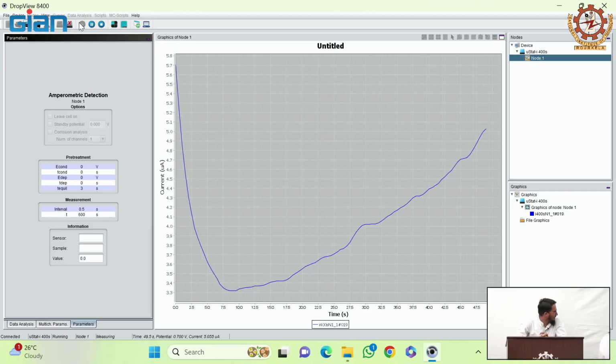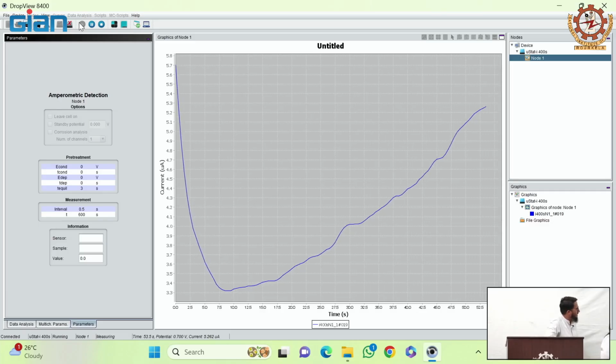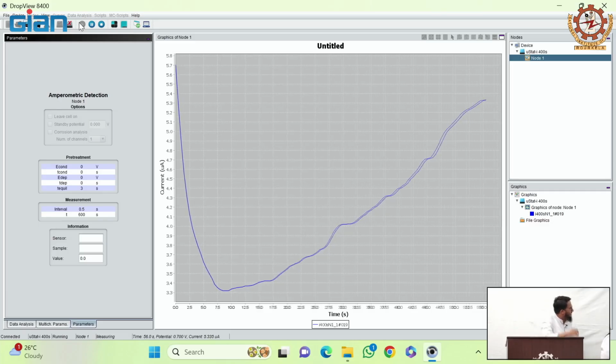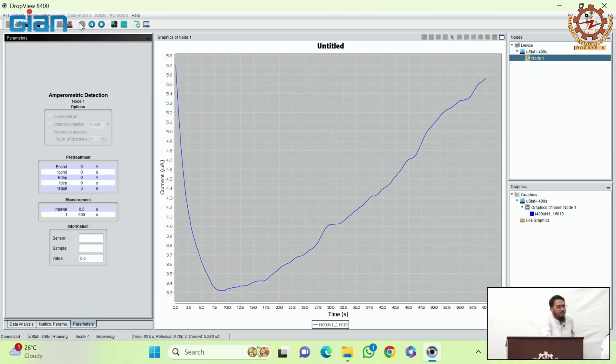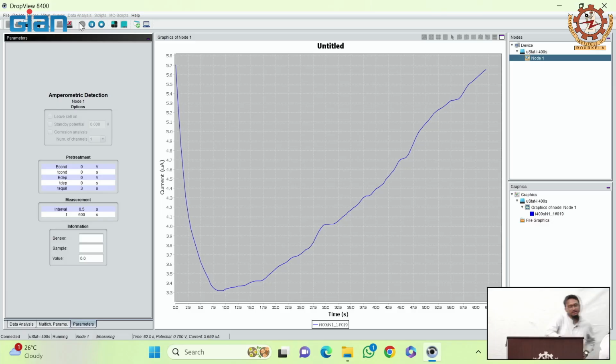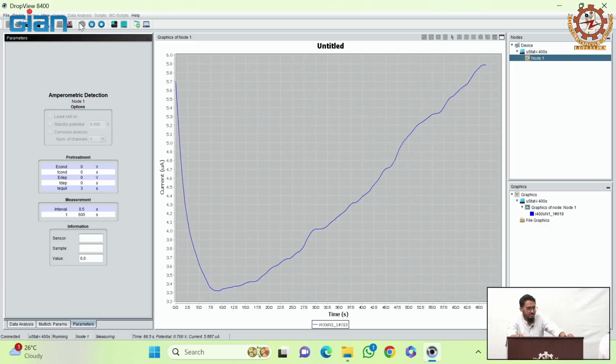So this is a very short duration. As we keep it running for 600 seconds, there is a little bit of disturbance due to various factors. Here we are using the external counter electrode. In the calibration step, we will be using the PCB based counter electrode.